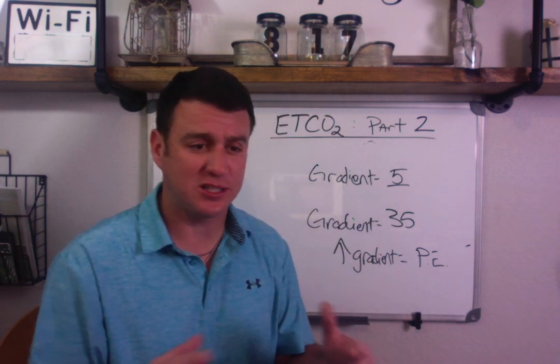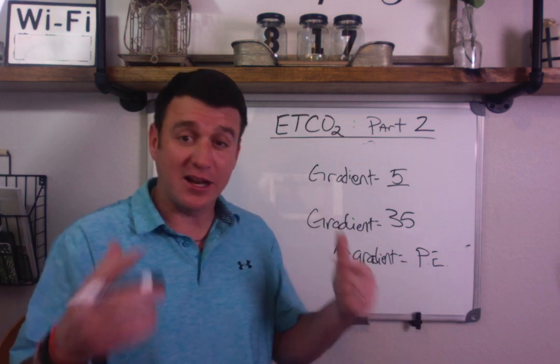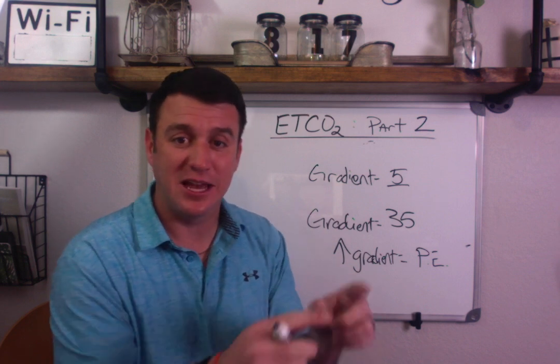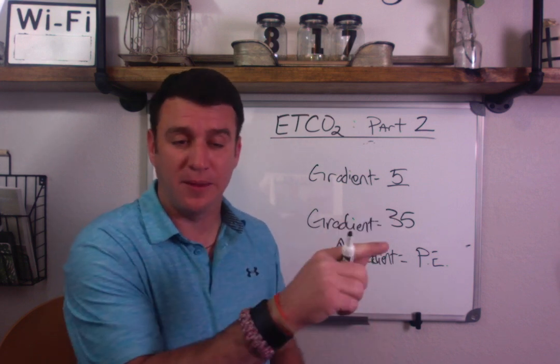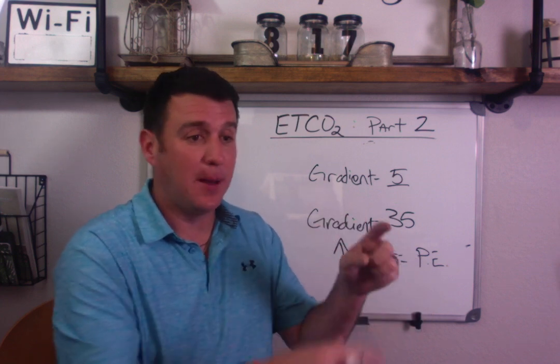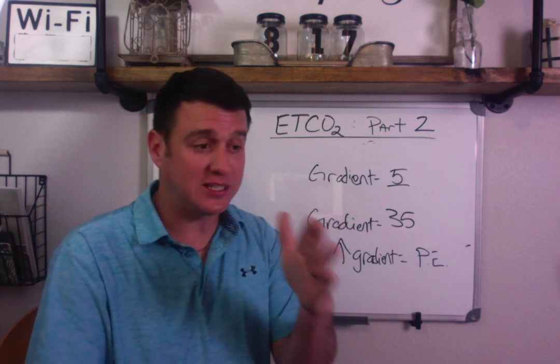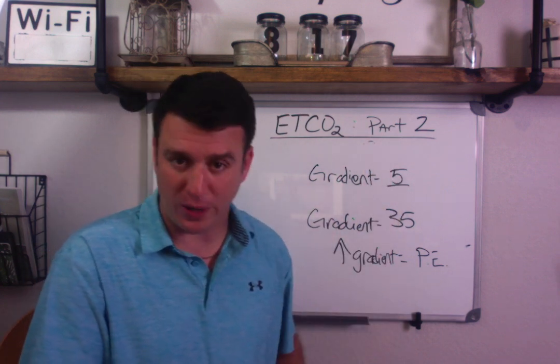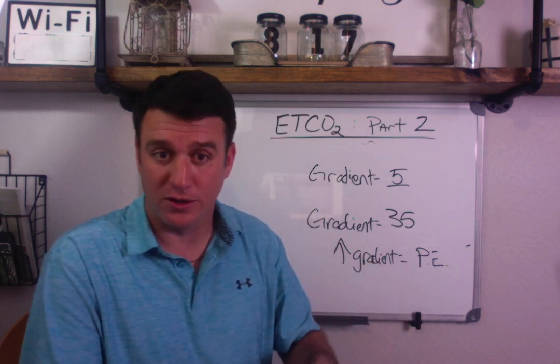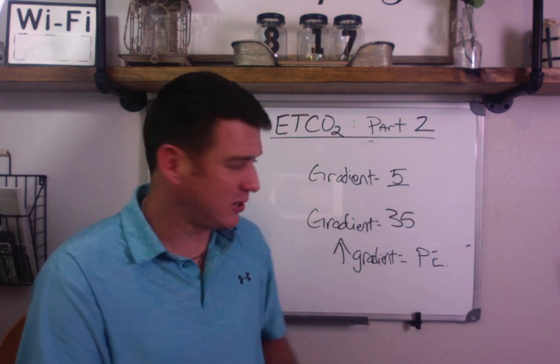You guys know what I'm talking about. Some of these people try to get up there and do compressions forever. Like, I never get tired. And in their minds, they don't get tired. But we can objectively assess their level of perfusion back to their level of adequacy of compressions with an end-tidal CO2 monitor. So use it in your code blues so that you can assess adequacy of compressions and recognize healthcare provider fatigue earlier so that we can get new, refreshed people that can better circulate that blood.